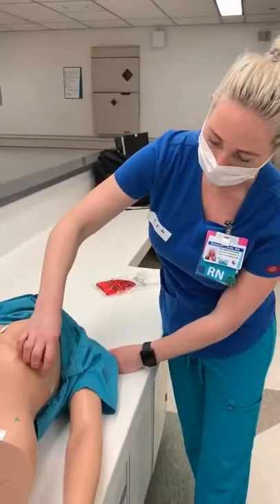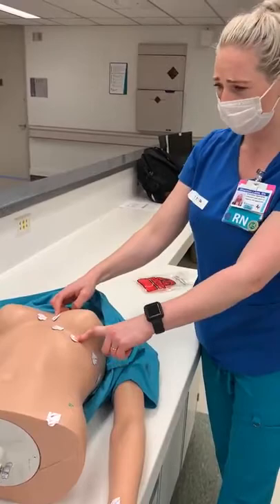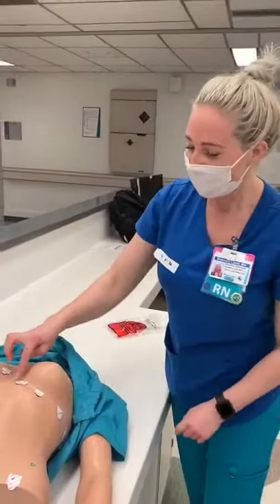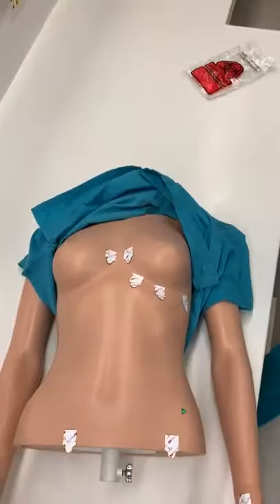I then backtrack and place V5 right in between V4 and V6, still in the fifth intercostal space. Then I backtrack and place V3 in between V2 and V4, also in the fifth intercostal space. So those are your precordial leads. Your patient is now ready for you to move over to the machine, get the machine ready, and hook that up.